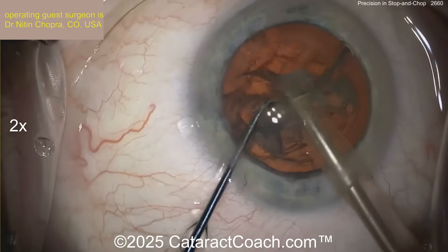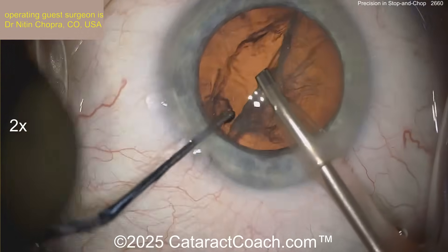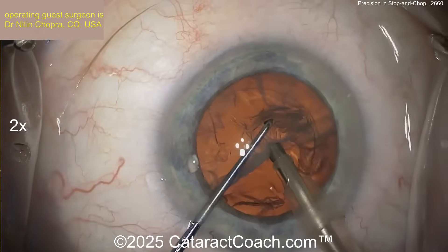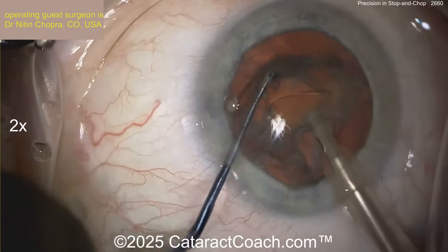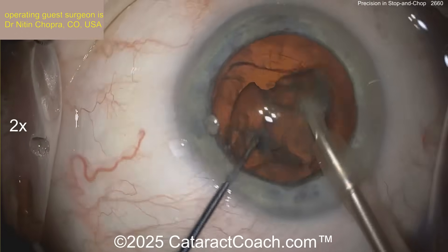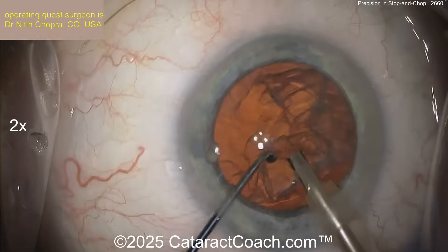Here we go. For this part, you certainly have to use higher vacuum and higher flow — at least 400 or 500 millimeters of mercury for your max vacuum. Here comes the second half of the nucleus, bringing that forward. There's the chop. So it's kind of halfway between a divide and conquer and a stop and chop. Stop and chop is a really nice technique.